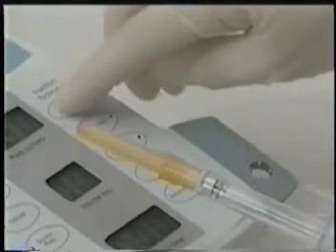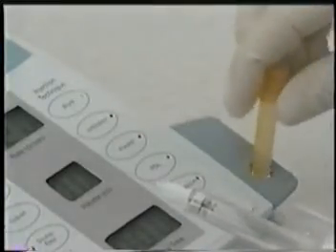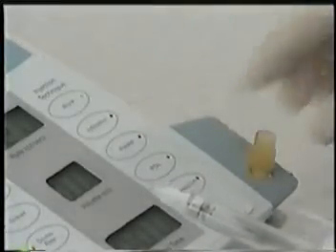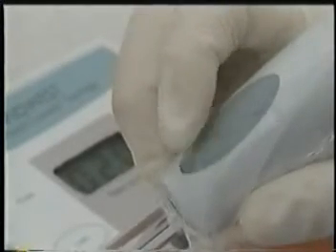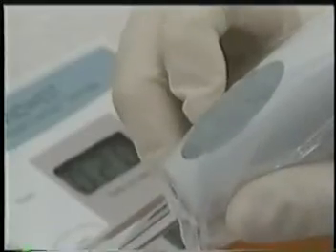Remove needle cap. If your CCS is located on a counter, use the recap station located on the handpiece holder. If wall-mounted, use your standard recap station. Press the start button. Once you see liquid drops at the needle tip, press the stop button on the handpiece. The needle has been cleared of air.